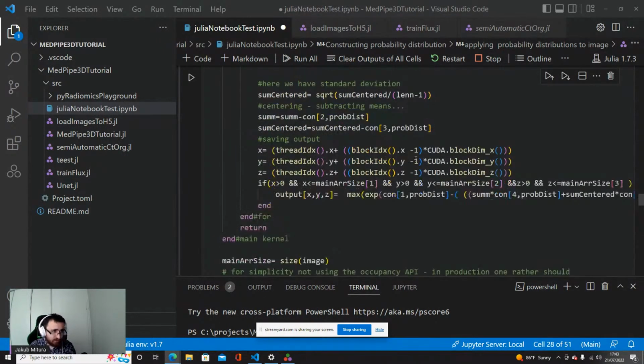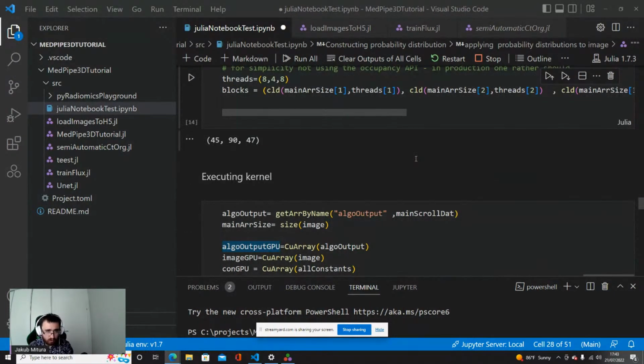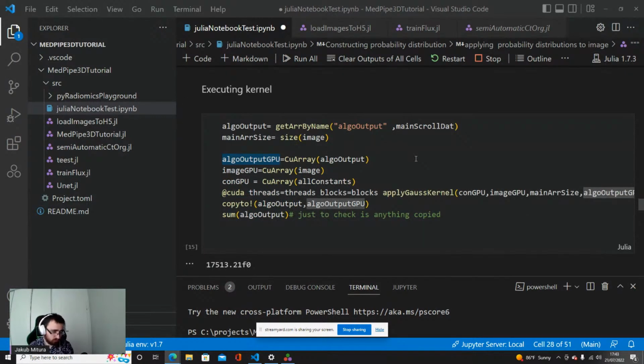I did not delve into this here. I did not try it even in this spot in the implementation of the metrics. In the more production code, it is implemented to maximize this coalescence whenever I am able to. Of course, I'm sure that it still can be done better than I did. I'm learning this, but there are still a lot of other things that I don't know yet. Okay, I hope that answered your question. If there is still something more, let me know.